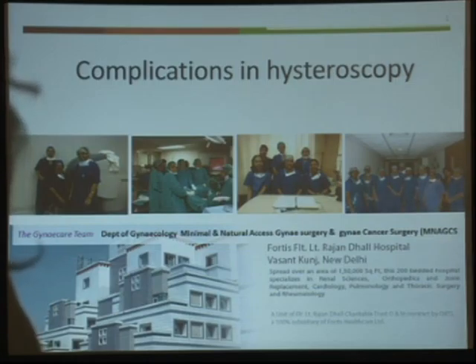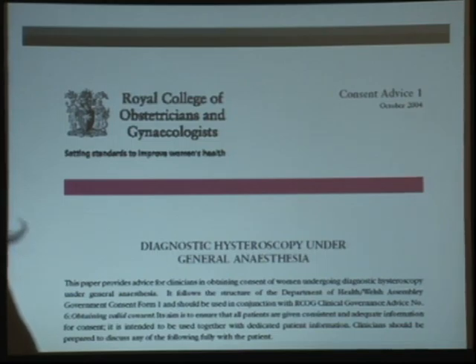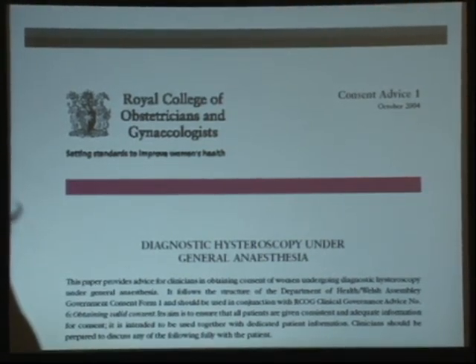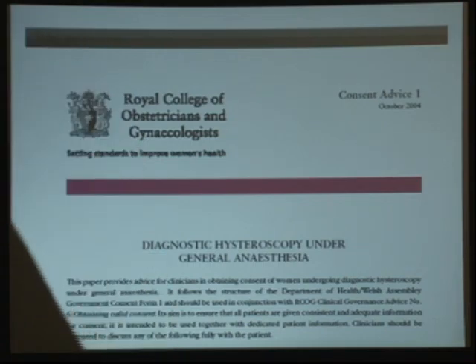Okay, so let's talk first about consent in hysteroscopy. This must have been discussed in the previous lectures, but it is very important to take a proper consent when you're doing a hysteroscopy, either diagnostic or operative. There's an RCOG consent advice which tells you how to take a consent for hysteroscopy.